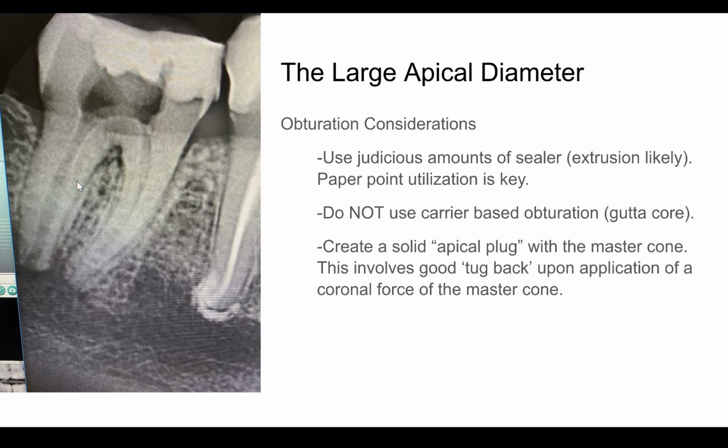The apical plug is softened because you just came out with the hot tip. Immediately go in there with a small condenser and gently apply apical pressure to further seal off that apical plug to create a nice backstop so that you can do your backfill without any chance of extrusion. That's basic warm vertical obturation. So there's nothing special there. It's just very important that you understand that apical plug is super important here. It's always important. And again, know your surrounding anatomy.